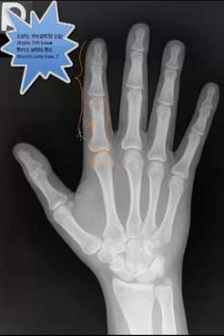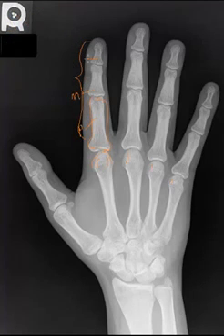You will have the proximal, you will have the middle, and you will have the distal phalanx. This is true again for the second through fifth digits. If we draw our attention to the thumb, you'll notice that there is only a distal and proximal phalanx. Therefore, there will be one less joint in the thumb.